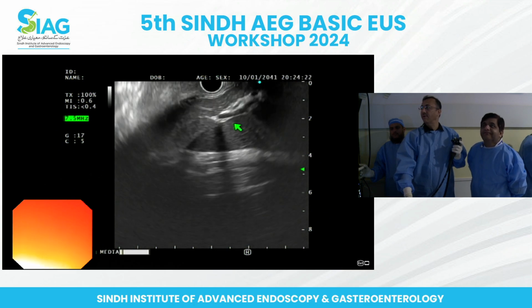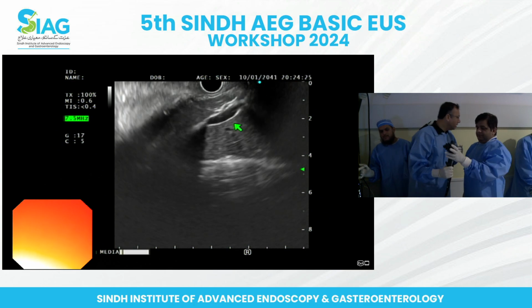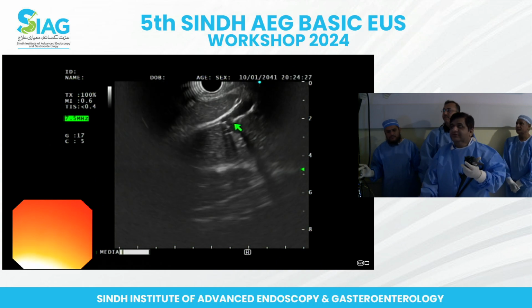So I'm going to give the endoscope to the candidate. Name? Shakir. Dr. Shakir.